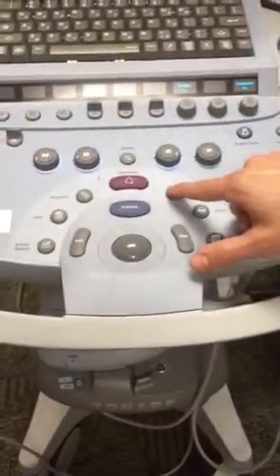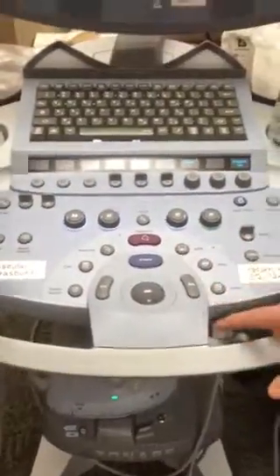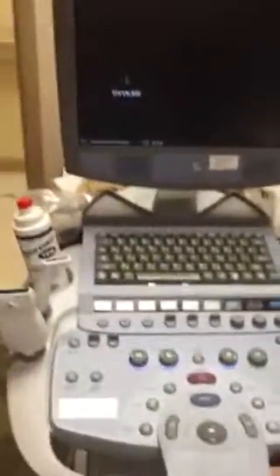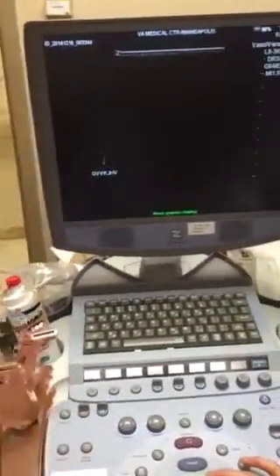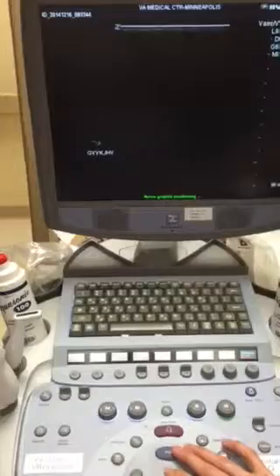Store. That's good. So you want to type first, set your arrow second. Because if you try to set your arrow first, when you go to type, it's going to take the arrow away.